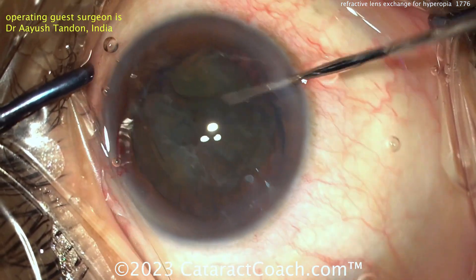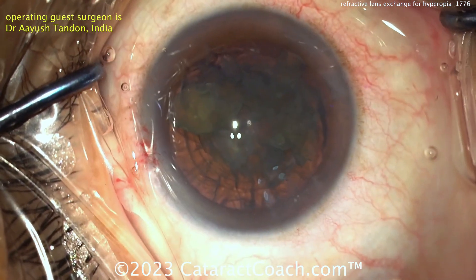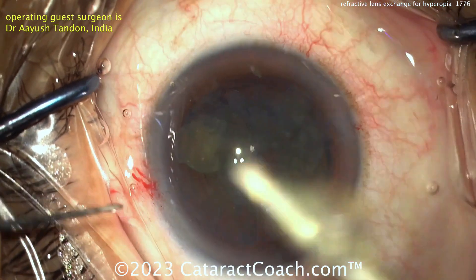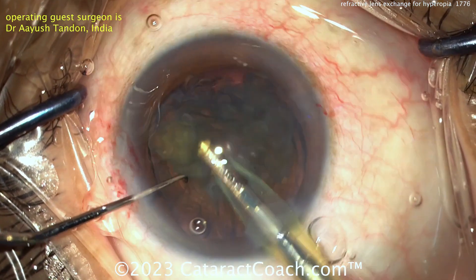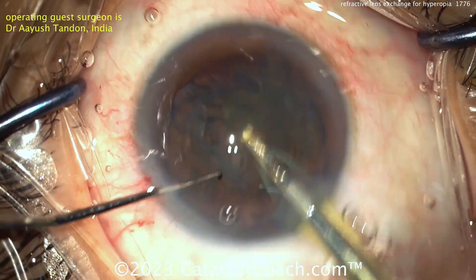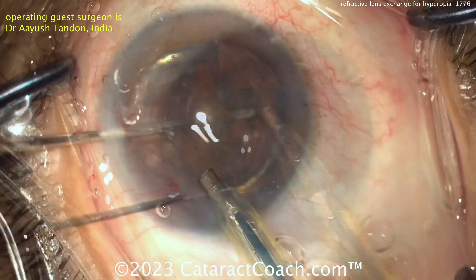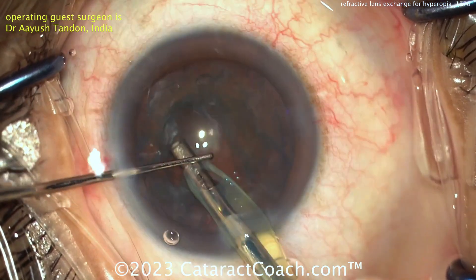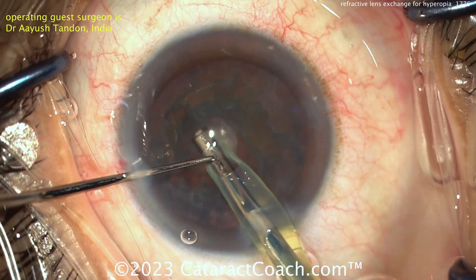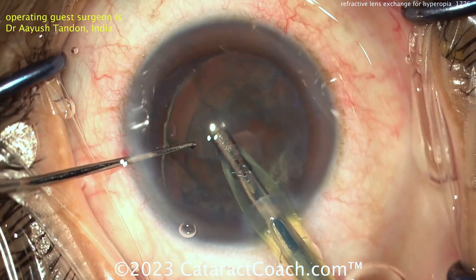It's very important you don't want to cause any posterior capsule trauma and have vitreous prolapse, especially in an eye having such an elective procedure. These eyes are typically correctable to just about 20/20 vision and you're doing this for primarily refractive purposes. Getting that lens material up — you're mostly using vacuum. Don't put a lot of phaco energy here because the nucleus is so soft you'll go right through it and you can nail the bag. Just vacuum like that and bring it on up.